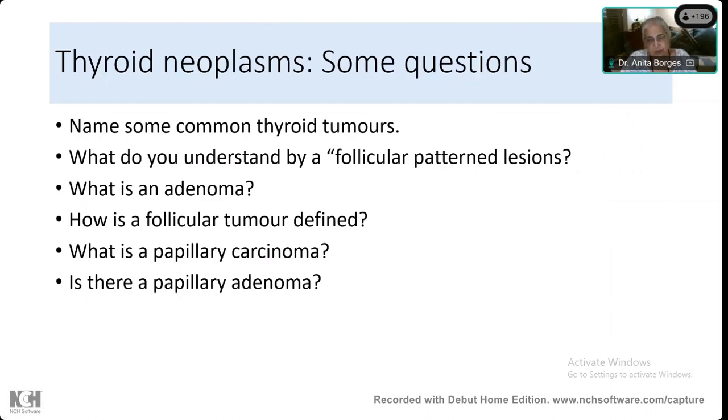It is a capsule around that benign tumor, and that benign tumor is obviously spherical, and it has a capsule that is outside of that tumor, which is separate, of course, from the capsule of the thyroid gland. So whenever you want to call something an adenoma in the thyroid, you have to look for this capsule.